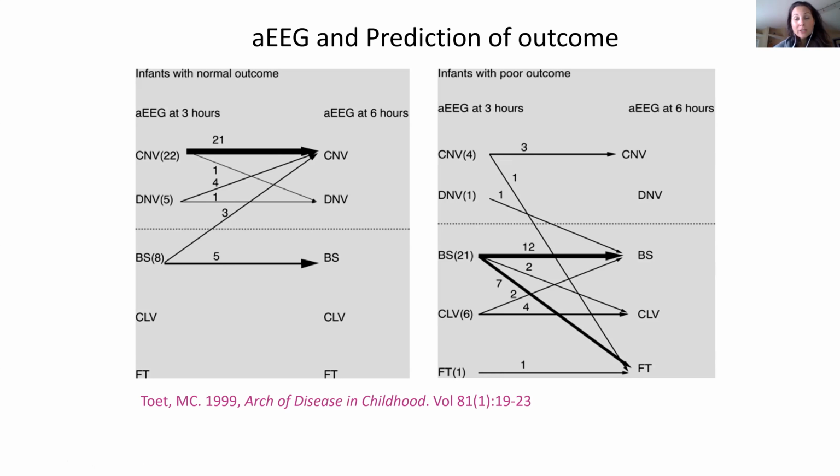These are still relevant if you end up having kids that you don't cool, that for some reason don't make it to the hospital, or who are catastrophic in other ways, and you don't cool them. These are still reliable numbers, but the majority of our babies are getting cooled.